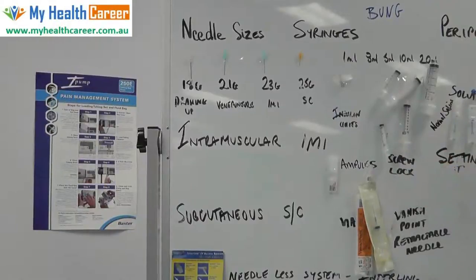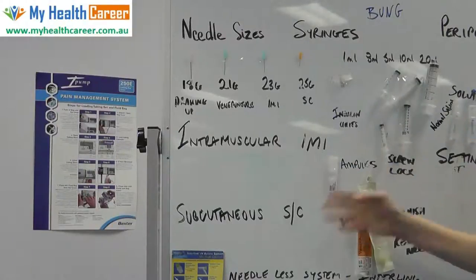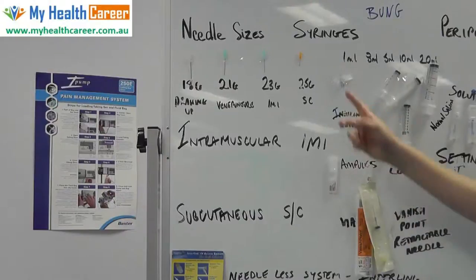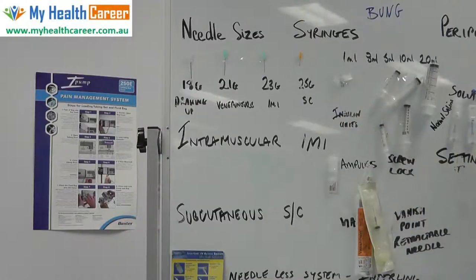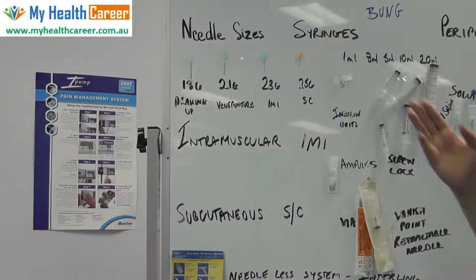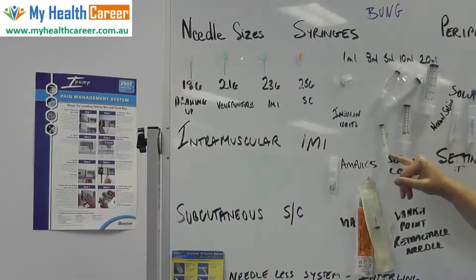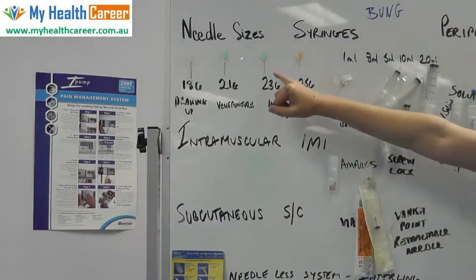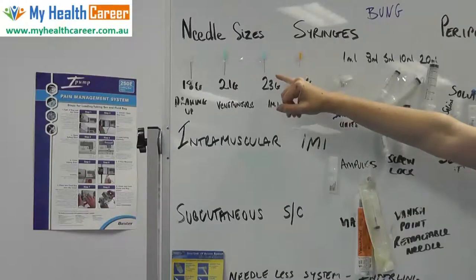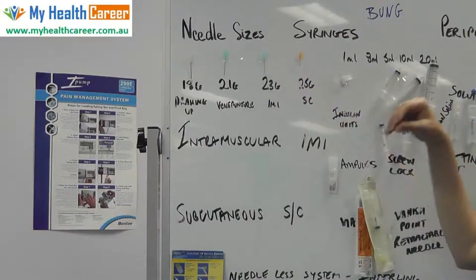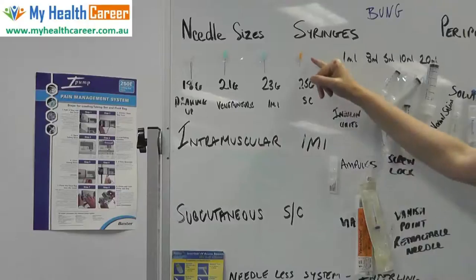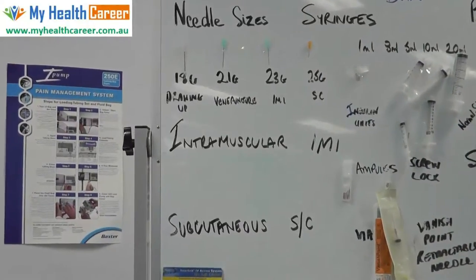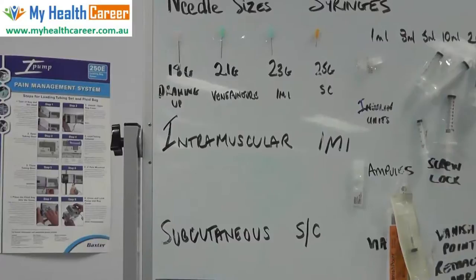An example of our syringe sizes — when we're administering drugs, be it intravenously or what we call intramuscular or subcutaneous, so this is via injection when we use the needle. When drawing up the injection earlier, we were using a small syringe with an intramuscular needle. You can see this needle is a lot deeper — it needs to go a lot deeper to get into the muscle. And this one's a lot shorter, which is what we call a subcutaneous injection, going into the fat layer of the tissue.